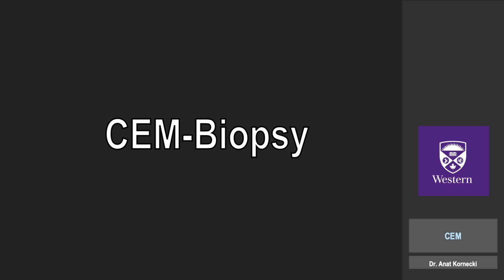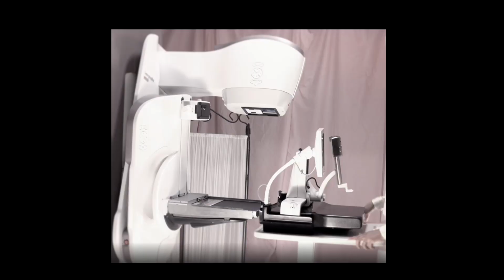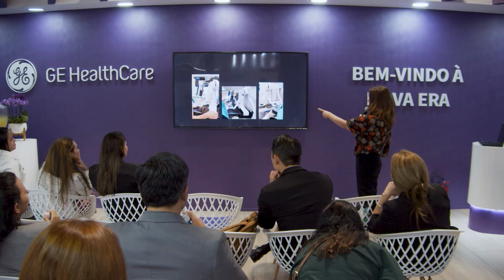And thank you again, GE, for introducing the word with contrast-enhanced mammographic-guided biopsy. Because before that, it was very difficult for people to adopt this modality. So this is an add-on unit, similar to the standard stereotactic guided biopsy, with the only difference is that now we use the software to enable dual energy technology. We can do that with the patient either lying down or sitting, in either upright or lateral approach, so either vertical to the breast or horizontal to the breast, as you see here.